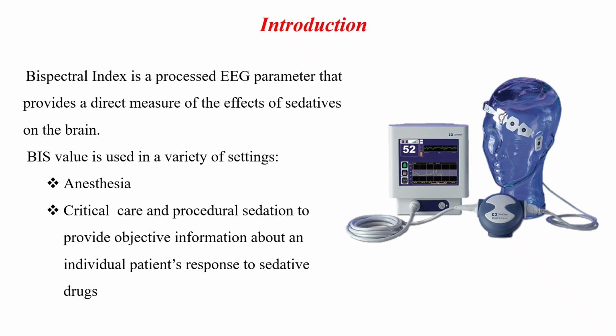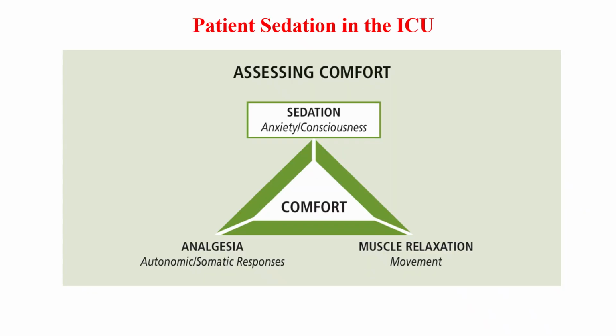Patient sedation in the ICU. Sedation in the intensive care unit is a critical component of patient management, especially for patients on mechanical ventilation or undergoing painful procedures.